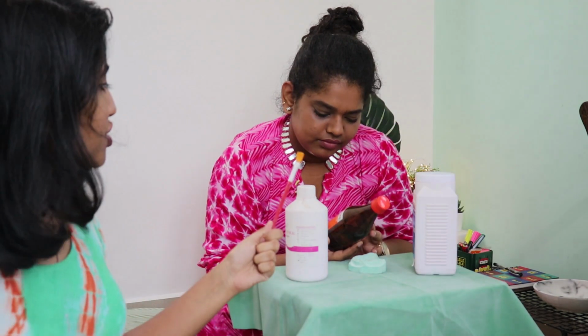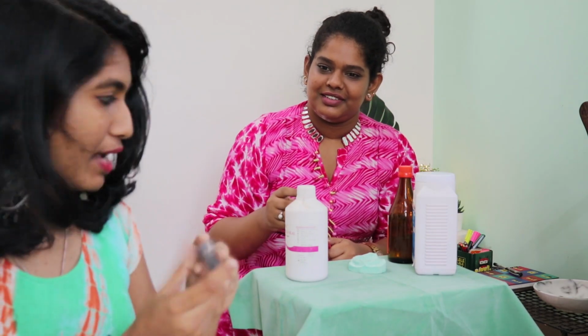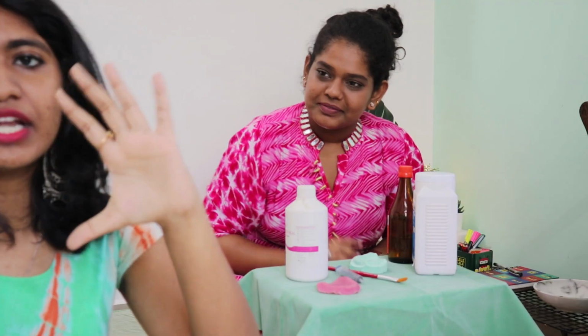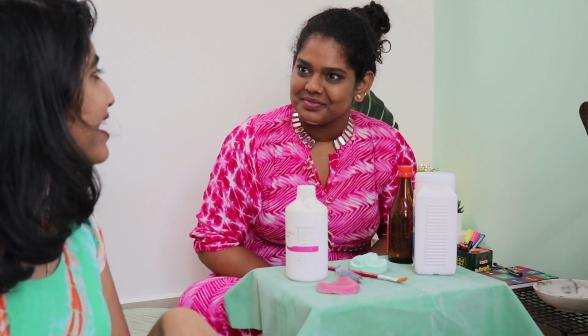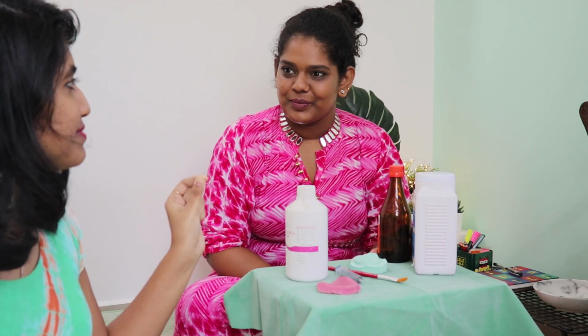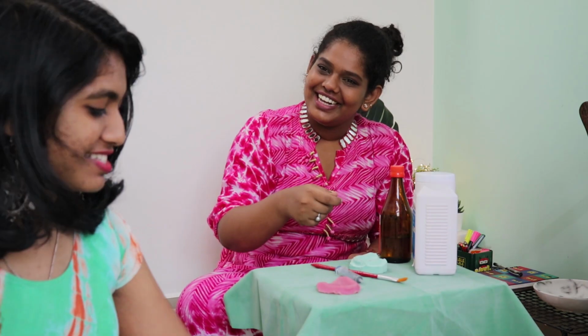So there is a paint brush for you, and then there is a syringe without a needle. You can have it with a needle. I don't mind this. So part 1. There is usually a dispenser in which you dispense this powder, but I lost it, it's in the locker and I forgot to bring it. My friend also didn't have it. So you are going to do it in your hand. It's okay, it's not a problem. We'll get you some tissue paper. Should we not have measurements? Nothing is necessary, no measurements.